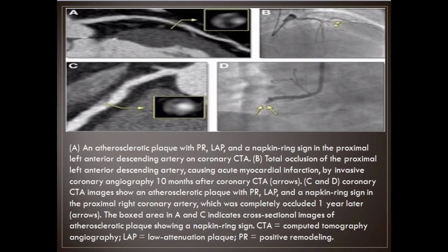Imaging examples: (a) an atherosclerotic plaque with positive remodeling (PR) and a napkin ring sign in the proximal left anterior descending artery on coronary CTA; (b) total occlusion of the proximal left anterior descending artery causing acute myocardial infarction by invasive coronary angiography 10 months after coronary CTA. (c) and (d) coronary CTA images show an atherosclerotic plaque with low attenuation plaque (LAP) and a napkin ring sign in the proximal right coronary artery, which was completely occluded one year later. CTA = computed tomography angiography; LAP = low attenuation plaque; PR = positive remodeling.